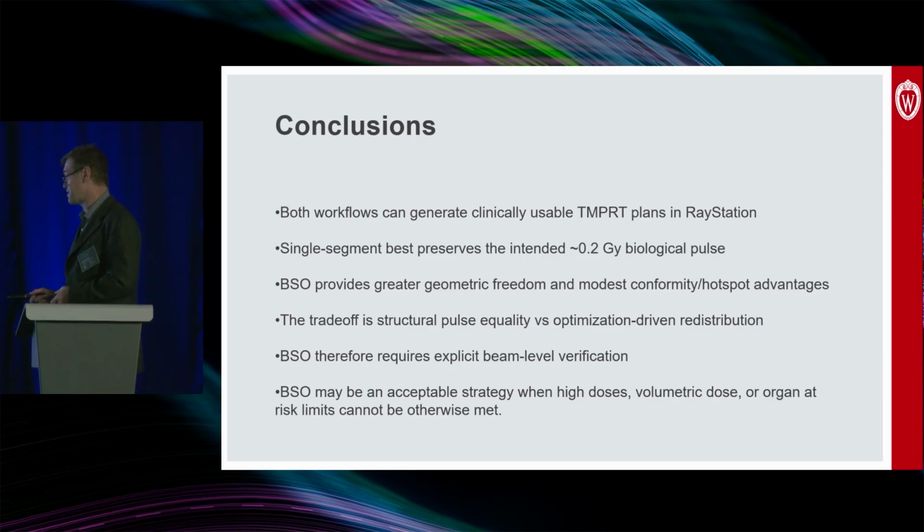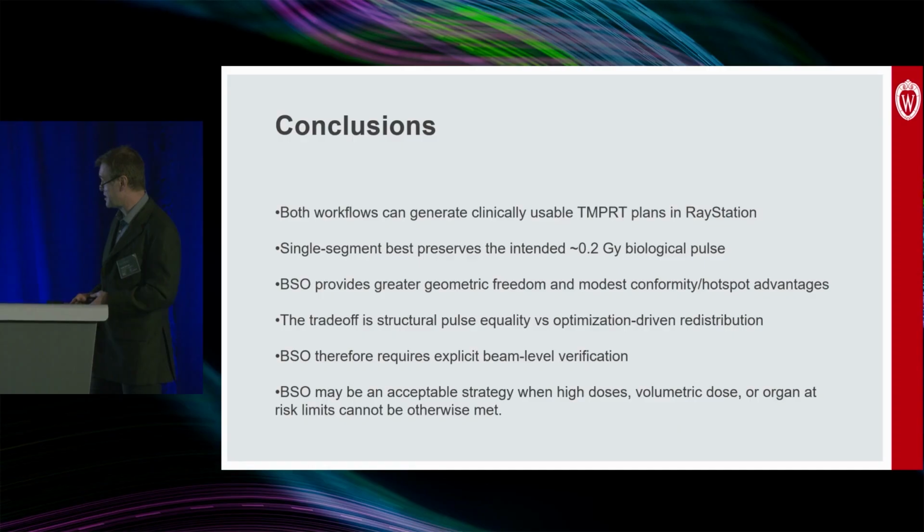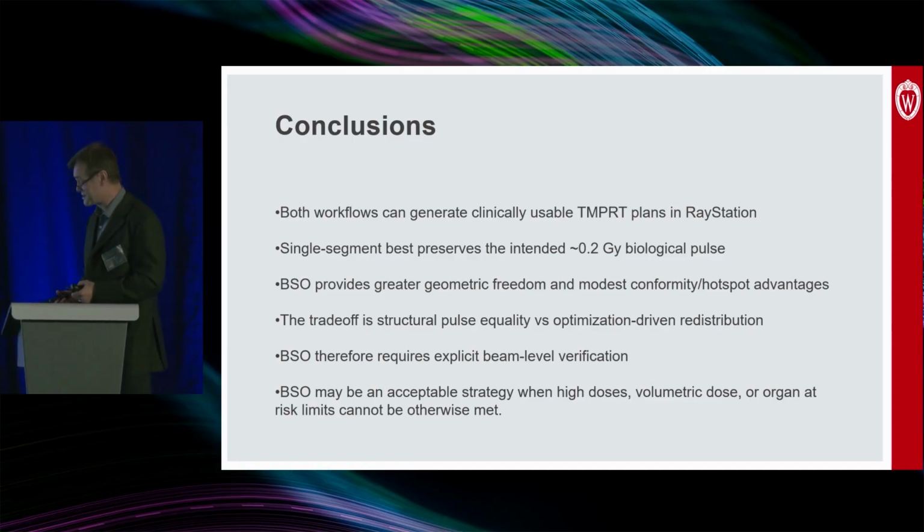The beam-specific objectives require a very explicit beam-level verification. You've got to go back in and make sure that these all meet. But it tends to be an acceptable strategy when high doses, volumetric doses, or organ at risk limits really can't be met. So yeah, that's the status of this trial, and I'll be happy to take any questions if there's time.